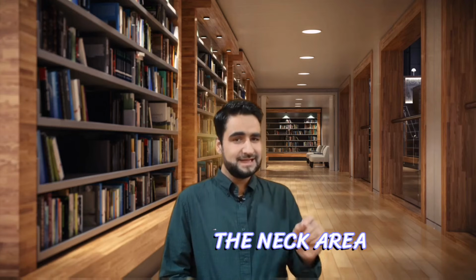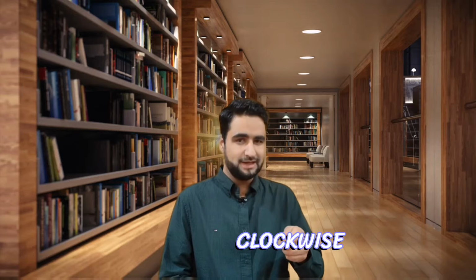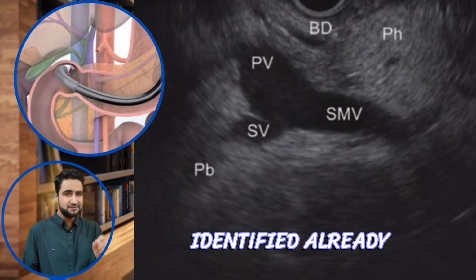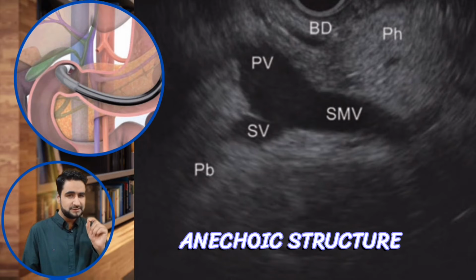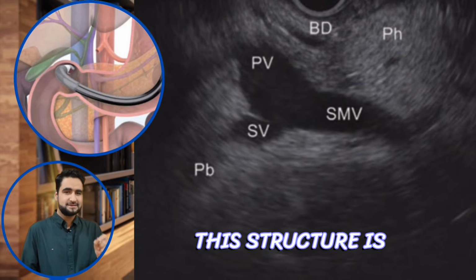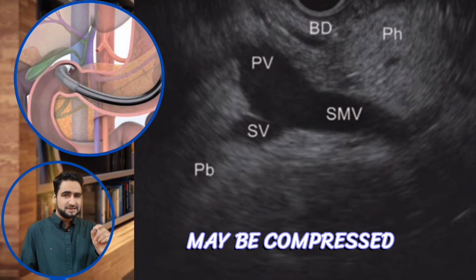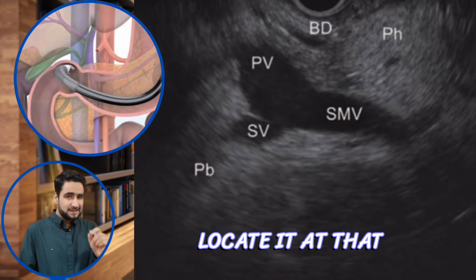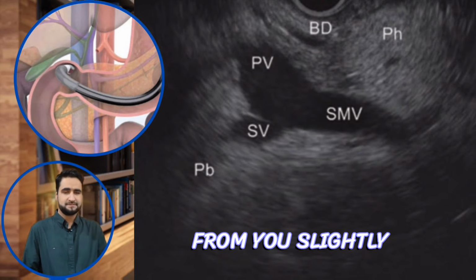After examining the neck area, you will again start rotating your scope clockwise. In addition to the vascular structures that you have identified already, you will look for a small tubular anechoic structure which is just close to the transducer. This structure is the common bile duct. Many a time it may be compressed by the transducer and it will be difficult to locate it. At that time you need to release the big knob by moving it away from you slightly.